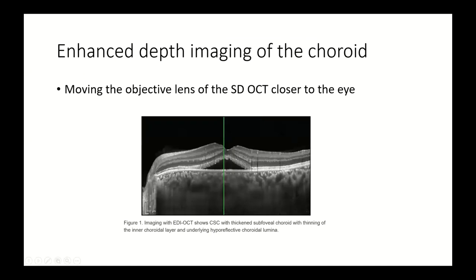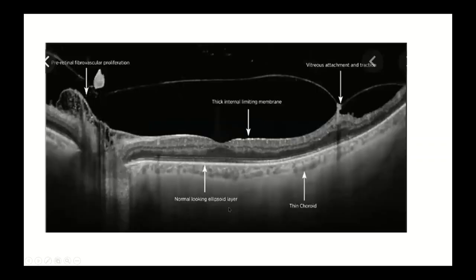Other than swept source and Fourier domain OCT, another technique to improve choroidal imaging is enhanced depth imaging — achieved by moving the objective lens of the spectral domain OCT closer to the eye. Here is a beautiful swept source OCT scan of a patient with proliferative diabetic retinopathy, showing pre-retinal fibrovascular proliferation, vitreoretinal traction, intact photoreceptor layers, and the choroid is also visualized.